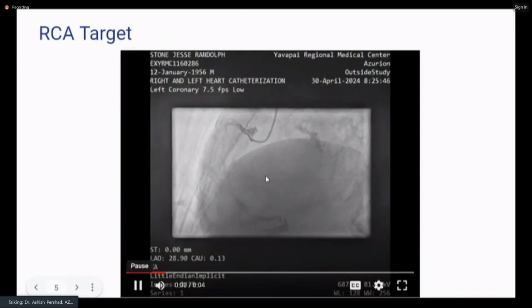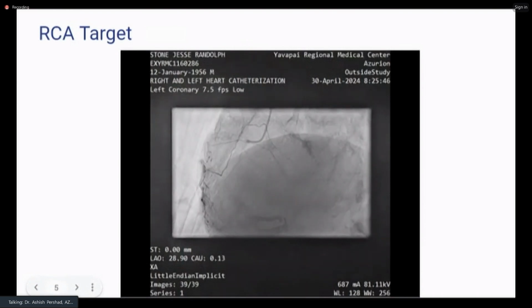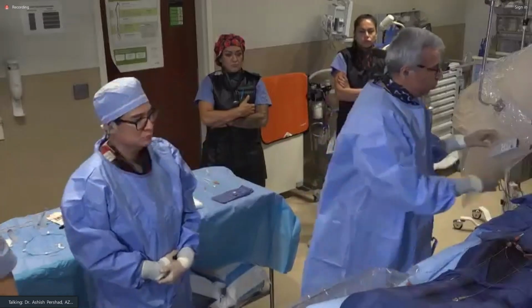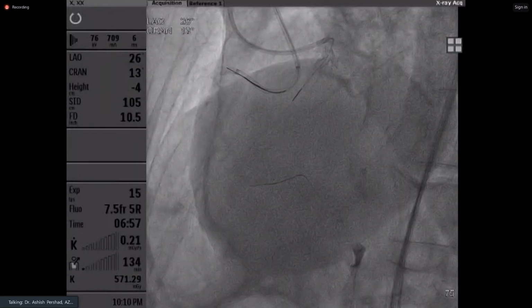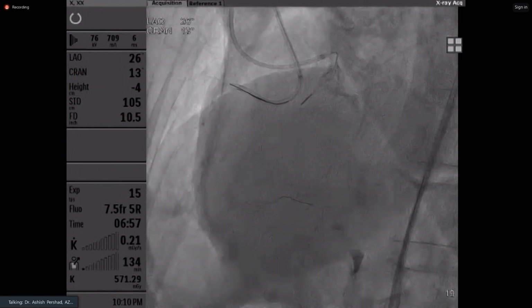Is that agreeable to everybody as far as the interpretation of the angiogram, or any comments, questions? I think that looks reasonable. We look forward to seeing the duals when you have them, so we can discuss strategies. Yeah, so the duals, I'll show them to you right now. I'll start with our first dual. Actually, sorry, let's go forward one more.